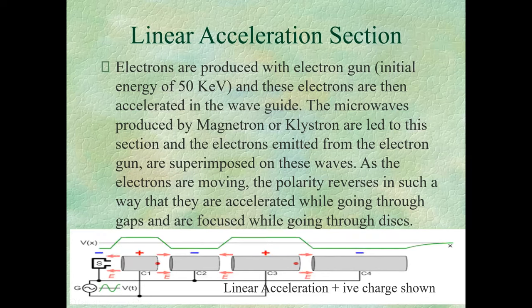And then the slot for wedges and accessories comes at the end of the accelerator. We have a place for placing wedges and accessories in those slots. So that's the head section of the accelerator.